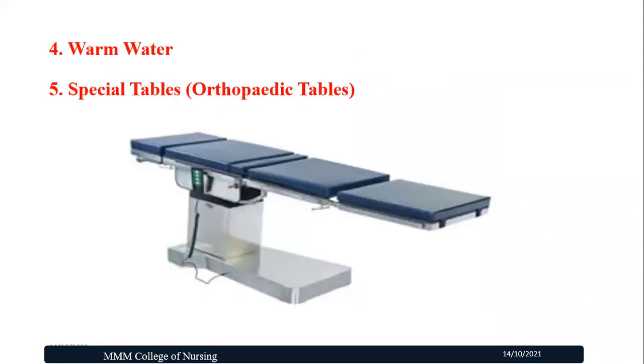The next thing we require for application of POP is warm water. Water should be kept at a temperature of 35 to 45 degrees Celsius, which is necessary to saturate the plaster bandages. The next is the special tables. We call them orthopedic tables. These are used for application of the cast. They have devices to support the uncasted area, leaving the area on which the cast is applied free.